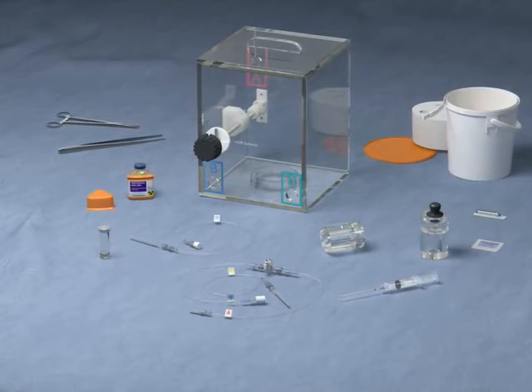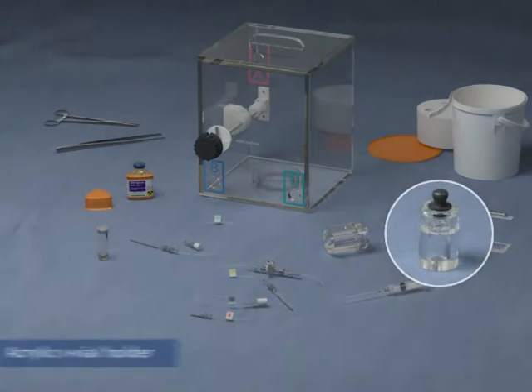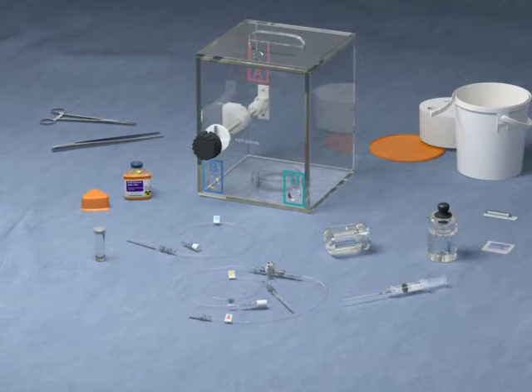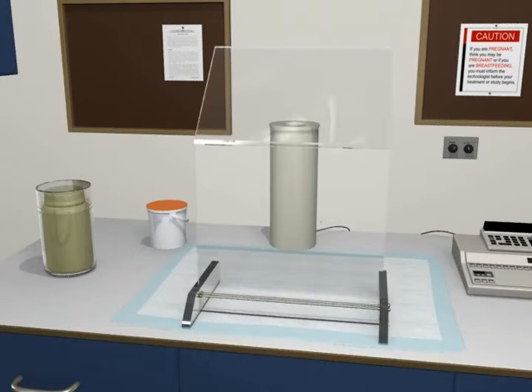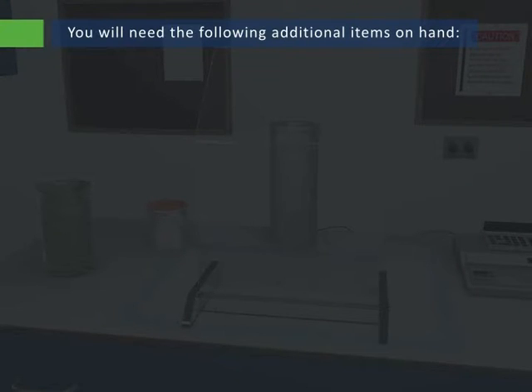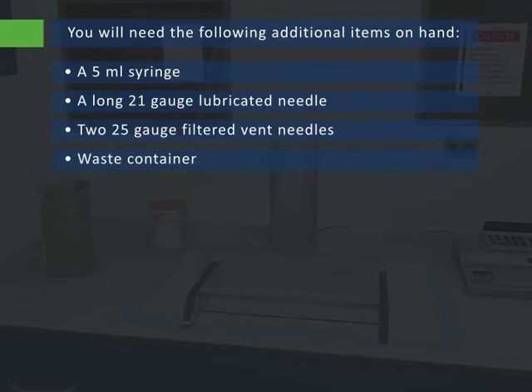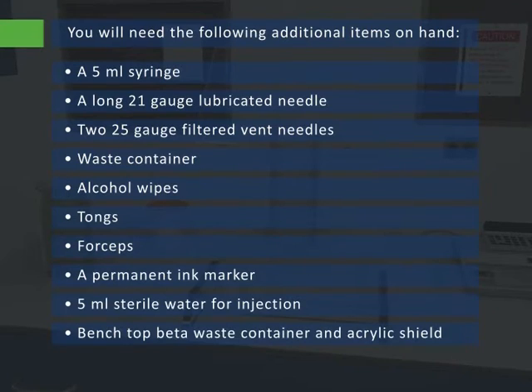The patient-specific activity is drawn from the shipping vial and transferred into the V-vial, which sits in its own acrylic V-vial holder. The provided syringe shield must be used to shield the syringe when preparing the dose. The V-vial holder can then be transported to the angiography suite where the patient will be treated. Before opening the dose, drape and prepare your work area behind the L-shield. You will need the following additional items on hand: a 5-milliliter syringe, a long 21-gauge lubricated needle, two 25-gauge filtered vent needles, waste container, alcohol wipes, tongs, forceps, a permanent ink marker, 5-milliliter sterile water for injection, benchtop beta waste container, and acrylic shield survey meter with beta probe.